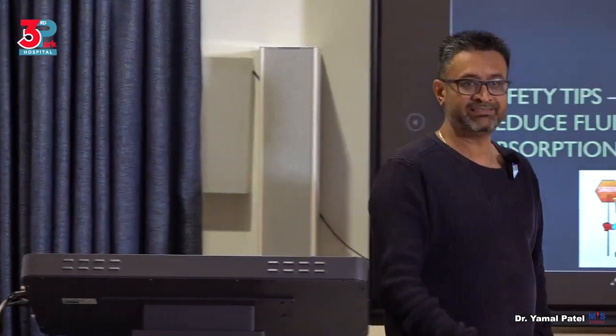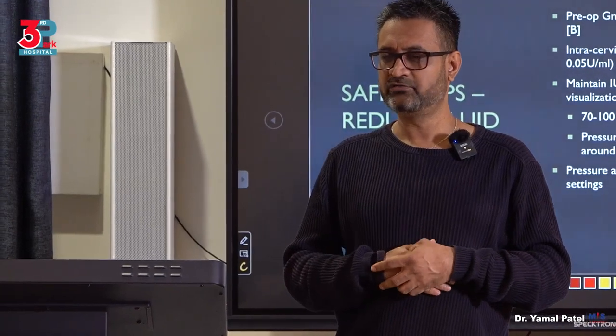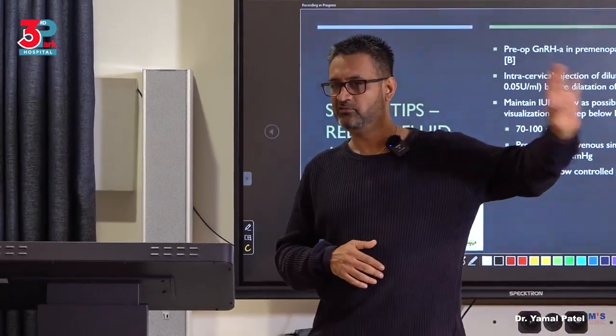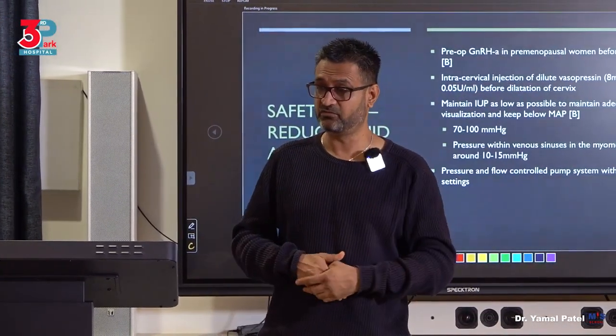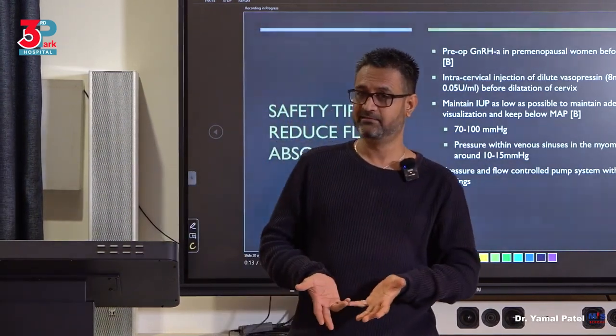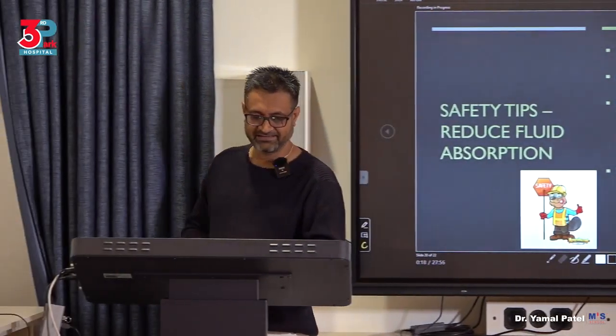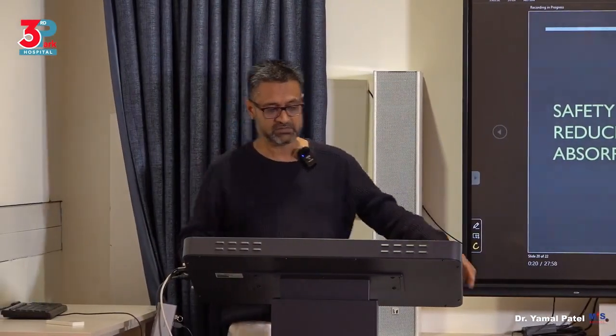And in a bipolar resectoscope, you use saline. That's why the new resectoscopes are all bipolar, because you don't need to worry about using the non-electrolyte solution and then getting the complications with that. Use a bipolar resectoscope with saline. You've understood? Good. So, safety tips to reduce fluid absorption.